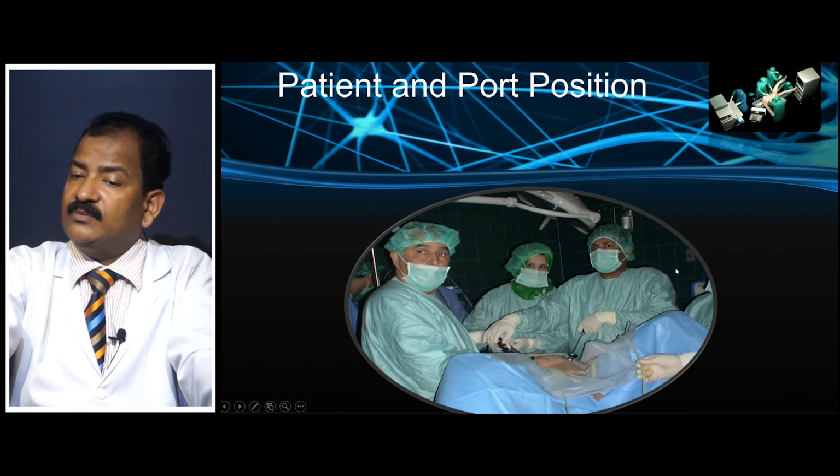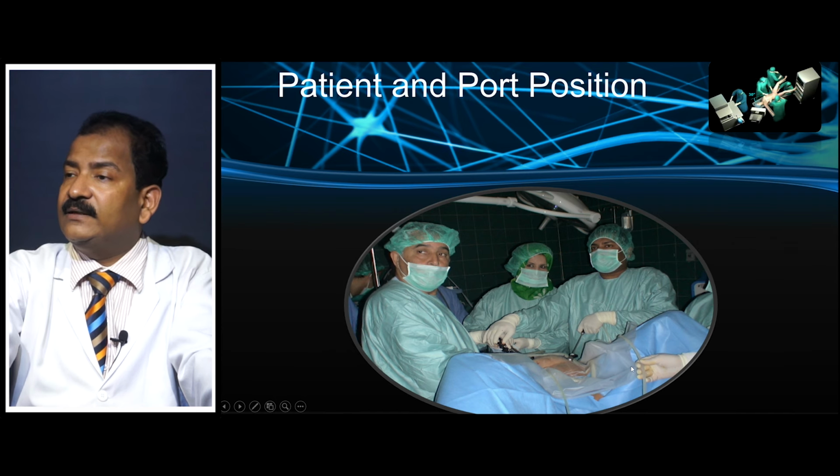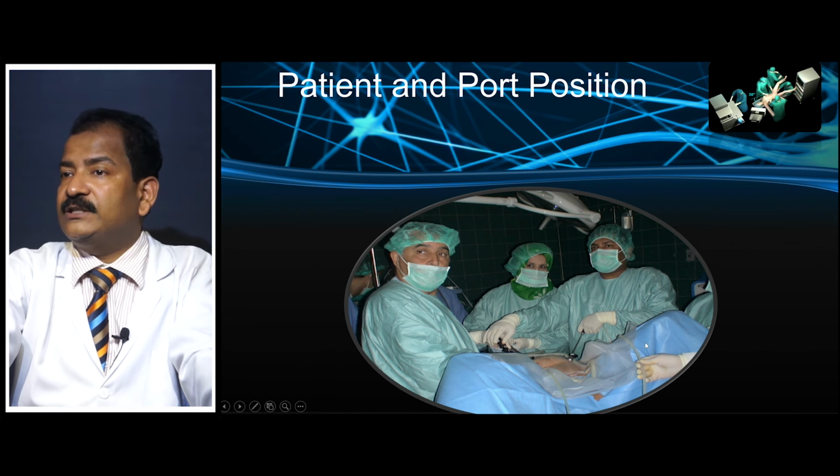and this is the usual position of the surgical team. The monitor is placed near the right hip, coaxial alignment will be maintained. One assistant in between the legs to do the uterine manipulation.